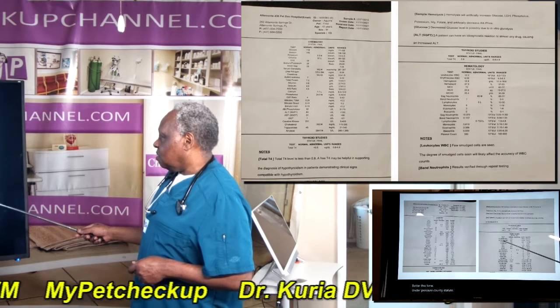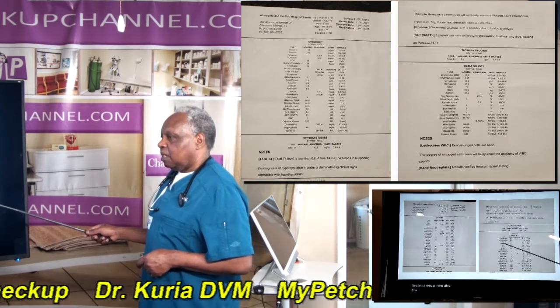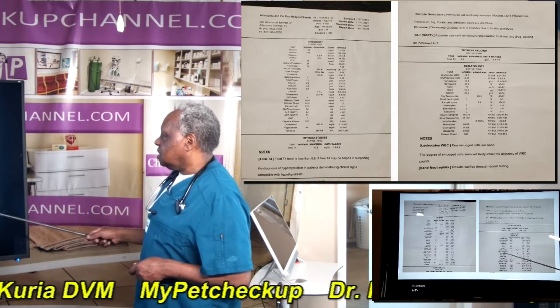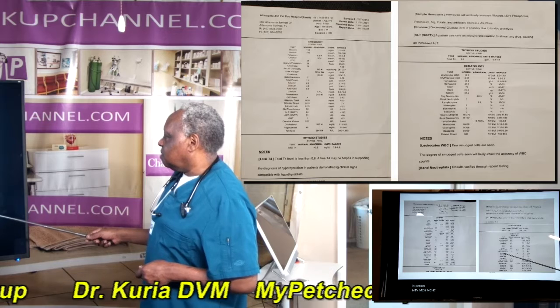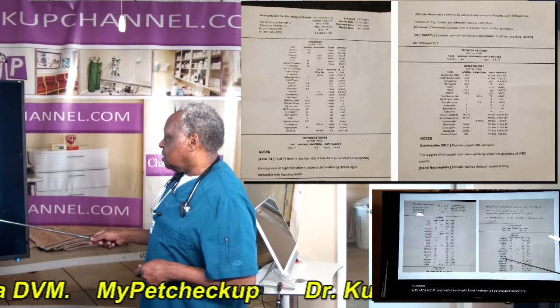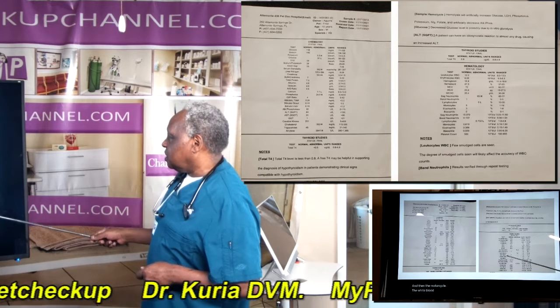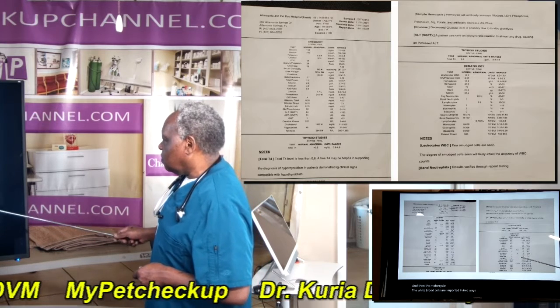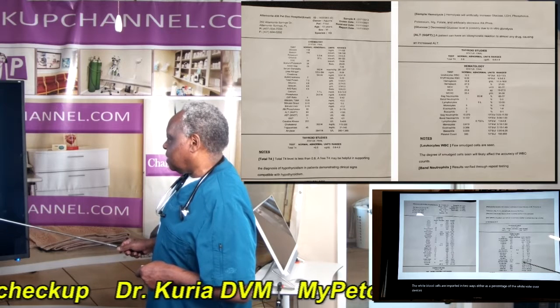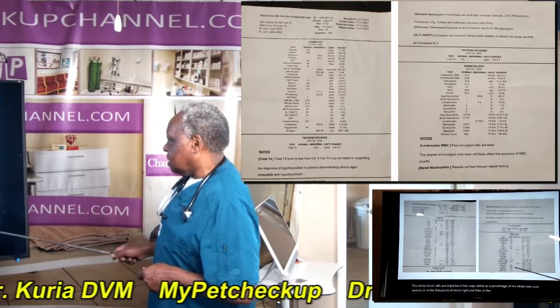red blood cells or erythrocytes, reports on hemoglobin, hematocrit, MCV, MCH, MCHC, segmented neutrophils, band neutrophils, and the lymphocytes. And then the monocytes, eosinophils, and basophils. The white blood cells are reported in 2 ways, either as a percentage of the total white blood cells or in thousands per microliter. All those are repeated again. And then at the end, you have the platelet count.